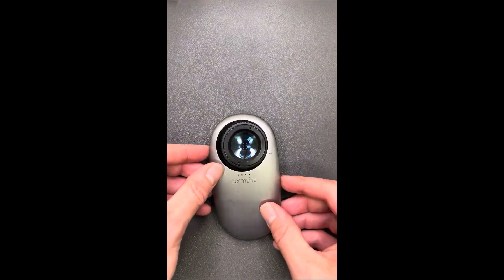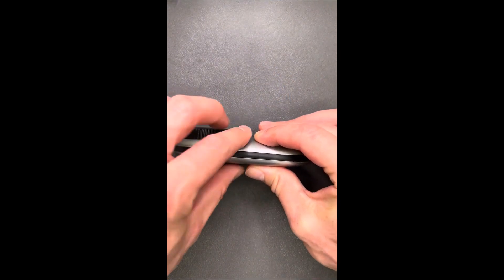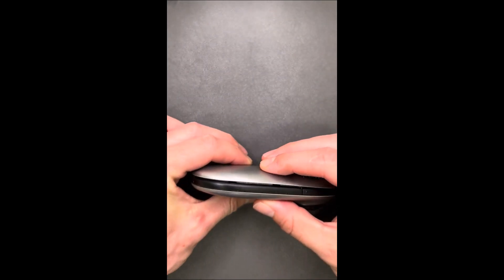You'll then realign the cover and apply gentle downward pressure, continuing along the perimeter until the cover is fully reattached on all sides.